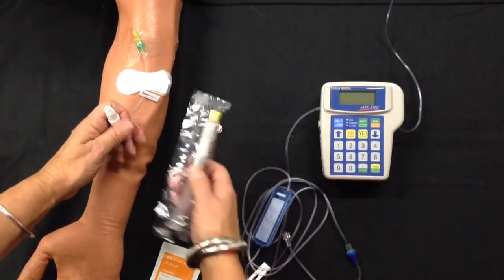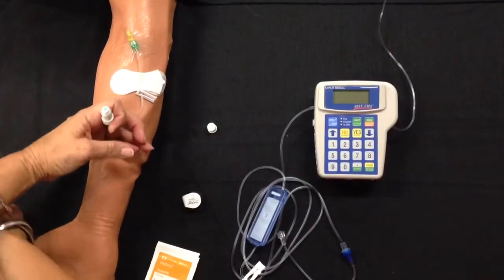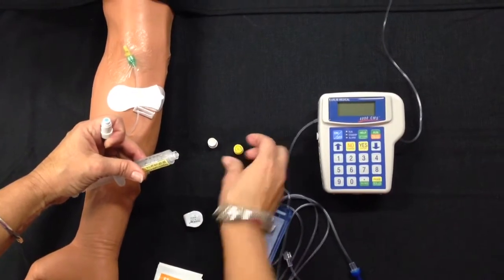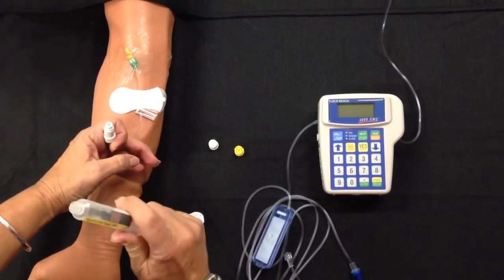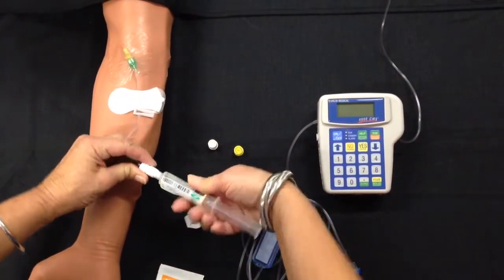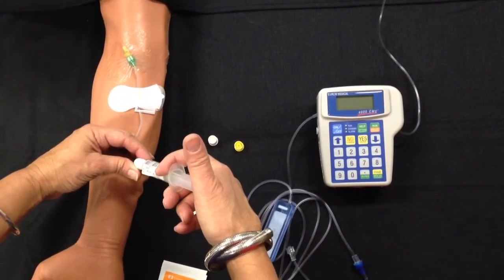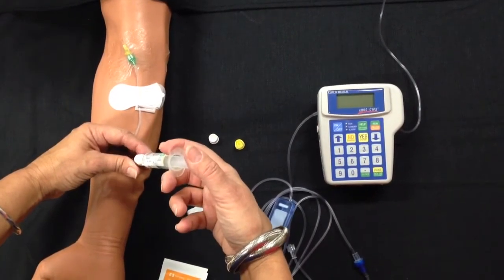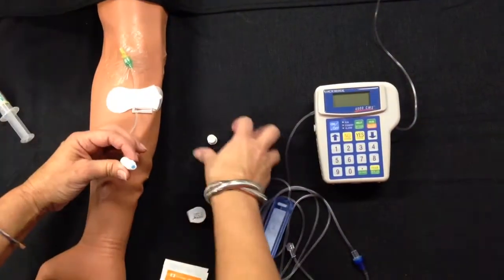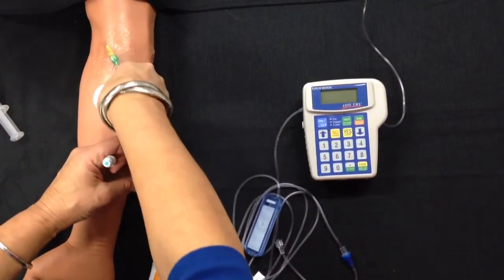If you've been instructed to use heparin, remove that. If you need to re-alcohol, if you've touched the end, remove the cap, remove the air, line it up, twist and push, and slowly push in the heparin, the entire syringe. Discard in the sharps container. The last thing you're going to do to your line is make sure you clamp it.